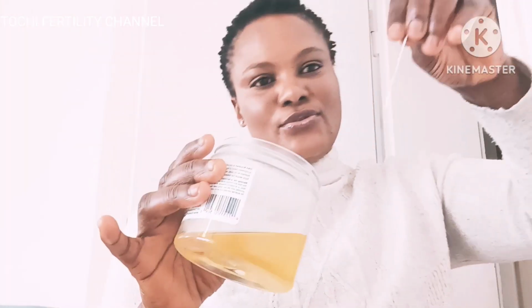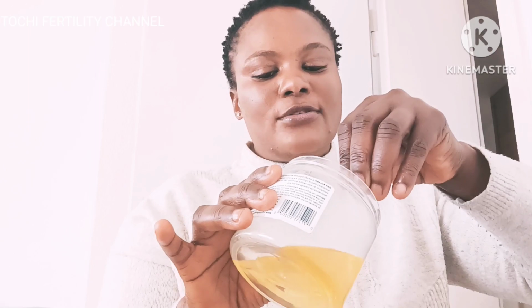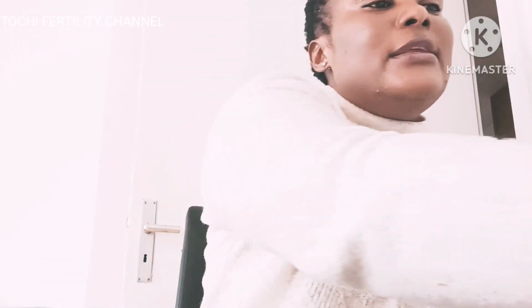So what I'm going to do, you see in this place? I don't know if you people can see me. You turn it like this. You see here, you put it into your urine. You count 5 seconds. 1, 2, 3, 4, 5. You bring it out. Clean a place. Make sure that the place you will lay this thing is very clean. Then you lay it. Within 2 to 3 minutes, it will show the results.